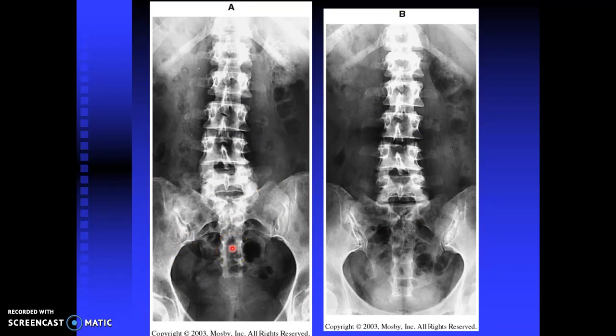And on a radiograph, we can see what that looks like. So with the legs not flexed, you can actually see kind of an outline of the vertebral bodies, and when they are superimposed into the disc spaces. Now, if you were to flex the knees, you're going to see these completely open disc spaces and only one outline of the vertebral bodies.